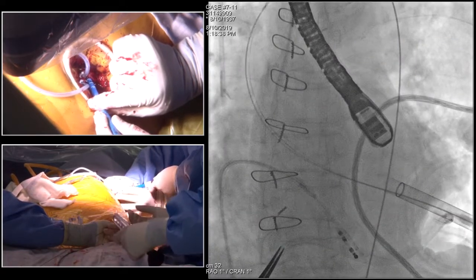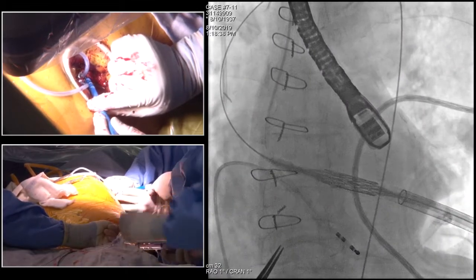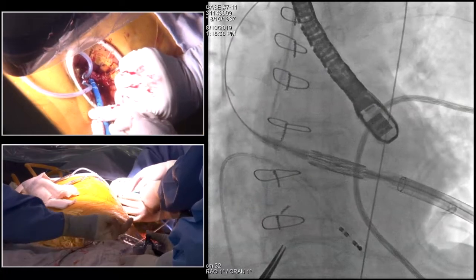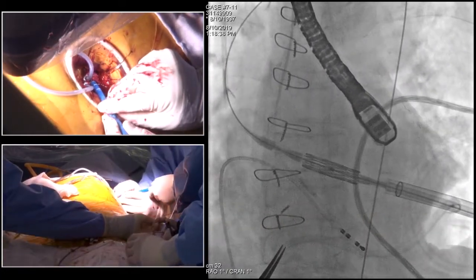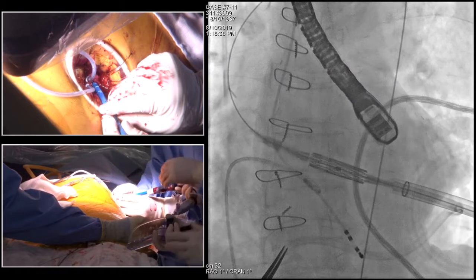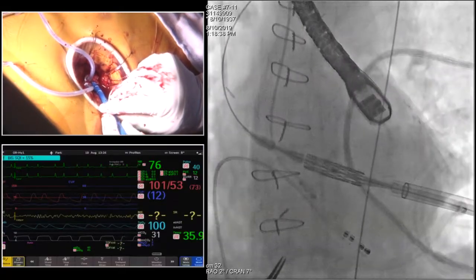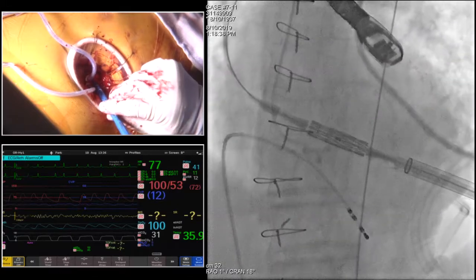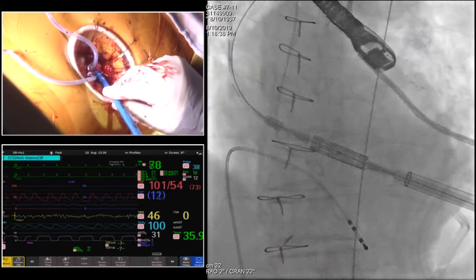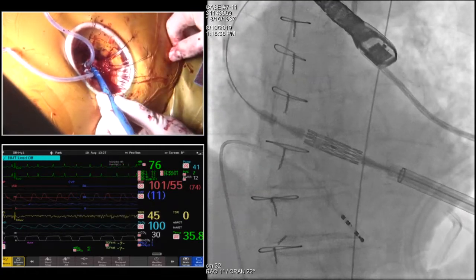Okay. Keep pressing the pedal. Personally, I heard that a cardiac surgeon, endovascular, had experience of hundreds of carotid cases, and he said that for us, the transcarotid approach for the TAVI is very fearful. What does he mean? Because it is not for the coplanar view. But his comment is, I have a lot of experience with carotid and the coplanar view. He said that the carotid artery is located there. So the surgeon said that it's quite easier to have a lot of experience. Keep watching the 4cm. And then I was really surprised and shocked. His comment is quite.